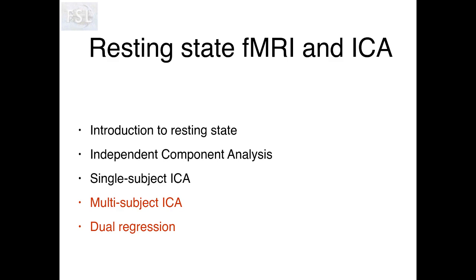Hi, my name's Paul. In the previous couple of talks, I introduced independent component analysis, also known as ICA, and showed how we can use ICA to clean up or pre-process single subject fMRI data.